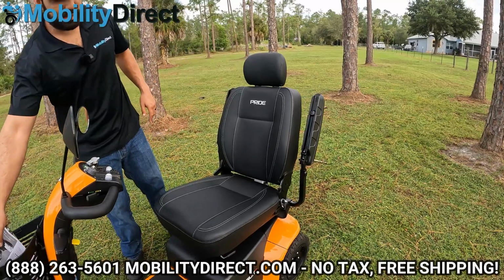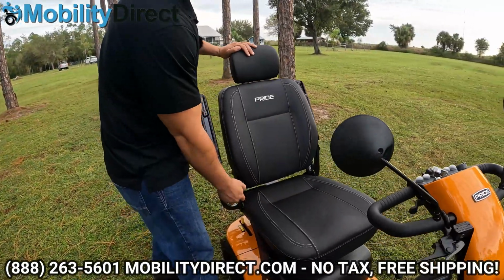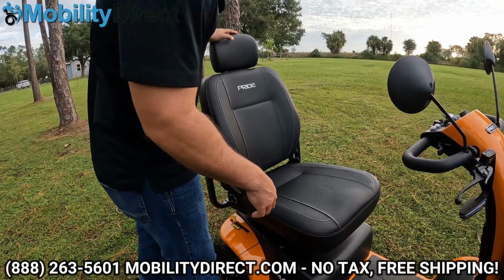Now, the seat has a bunch of comfort adjustment features. You've got a recline lever here, which will allow you to fold the seat forward. So if you take the seat off and you lower the handlebar, you can kind of put it in the trunk space of a van or an SUV. It's got a low profile. We'll show you how to do that in just a second.